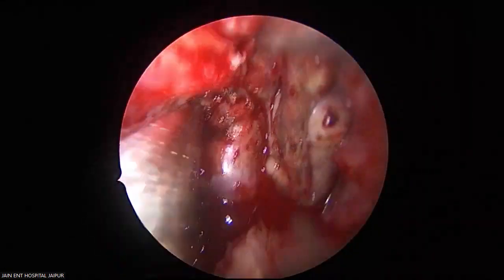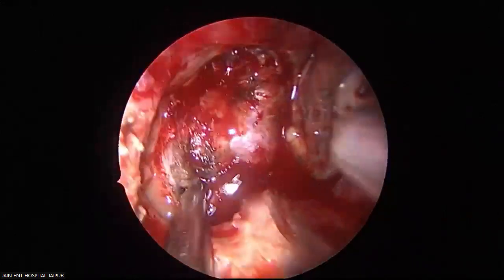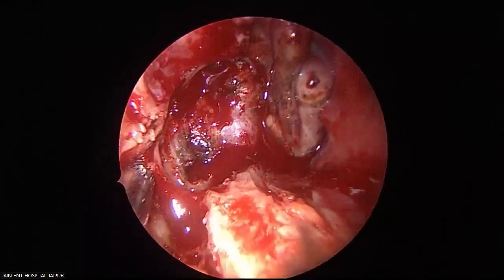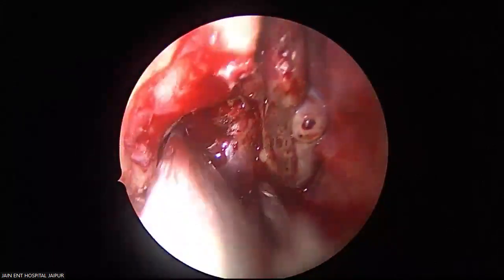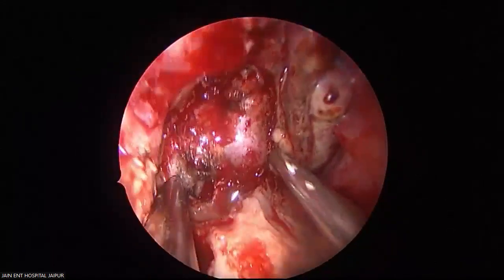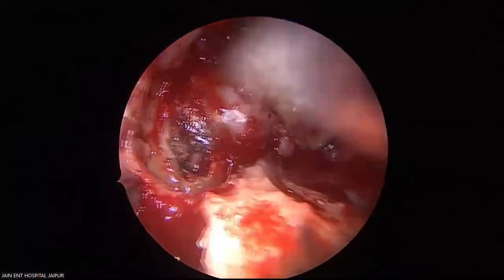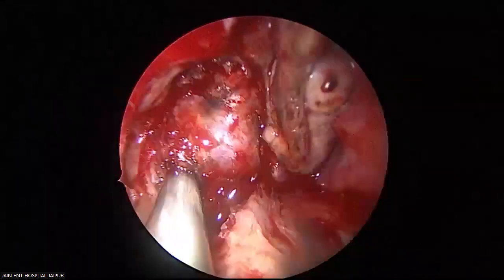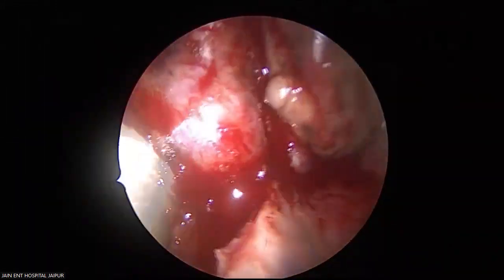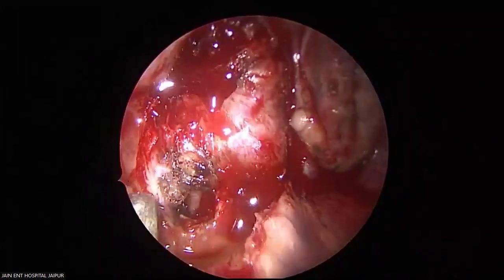Satish, how far laterally will you go? Laterally depends. See, this wall I have given anterolateral exposure. This wall I have given posterolateral exposure. Only this bone is left. There's a centimeter of bone left in between. See this? This is not an invasive tumor. This is just a pushing front, a curved section.